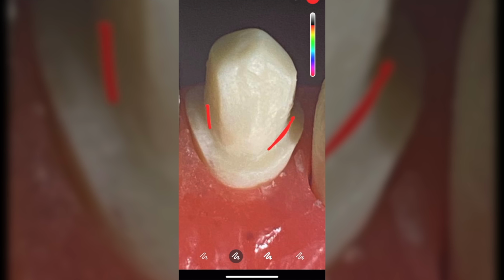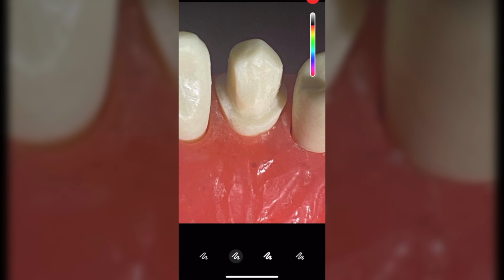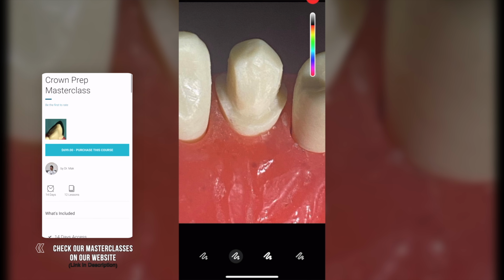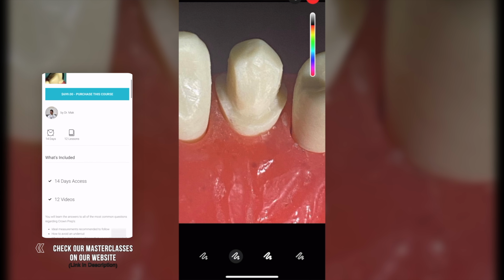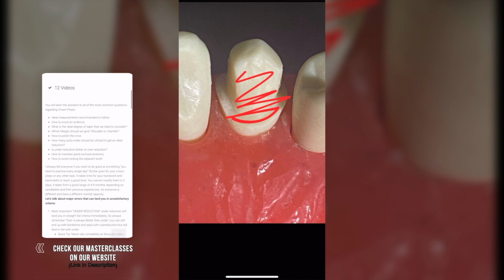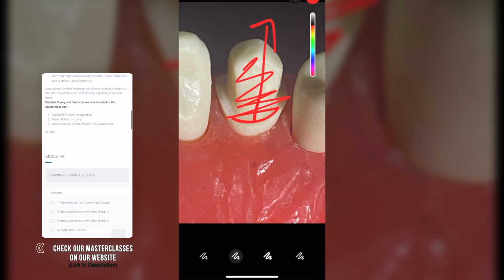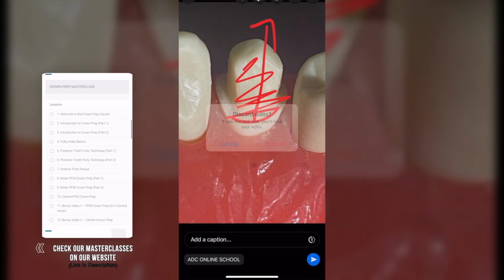Can you see there's a clear shadow here? That's your undercut right there. As soon as I see someone's palatal reduction, and because this is all done in indirect vision, and it is this rough and they have two undercuts there, what this suggests is that you're still not comfortable in indirect vision. That means I want you to practice more on indirect vision. The way to do that is take one tooth, take the same tooth, drill it all the way from palatal all the way to buccal so the tooth is completely gone. Do three of those and then you automatically will be better.